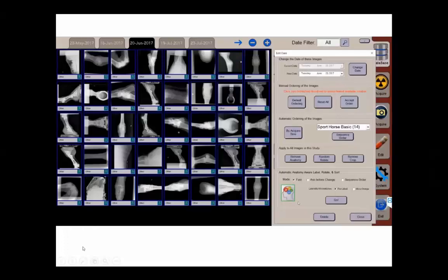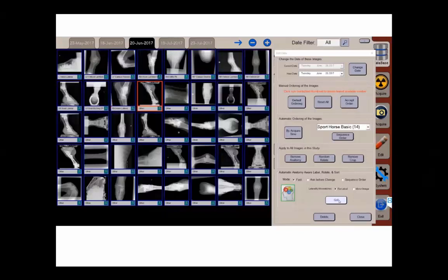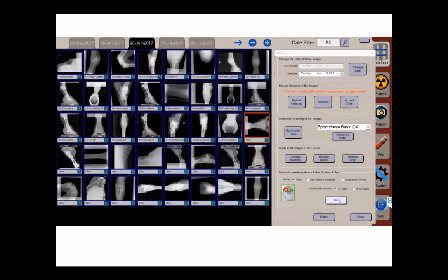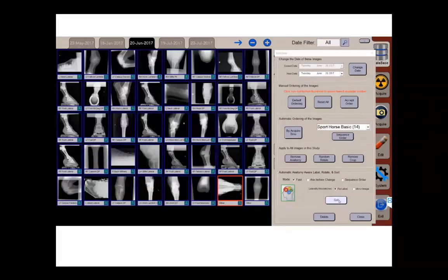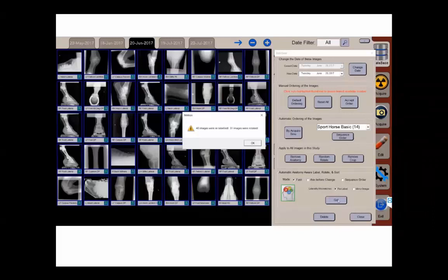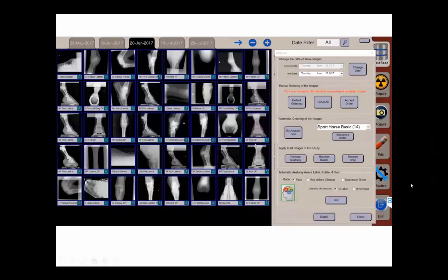And here, let me show you a first little demo. I'm running a video. I hope you can see it. And these are very small thumbnail images. They're randomly oriented and they're not labeled. And the red box is going through, and this is how fast it operates. It's identifying what the radiograph is, rotating it if necessary, and putting a label on it. So it goes about half a second per image. And there's 40 images here, and it's getting these all right, by the way. But as I say, it will make about 4% error. So that's kind of cool.